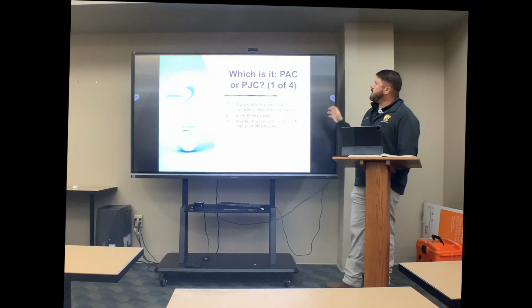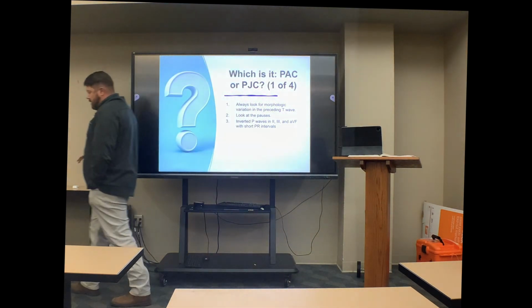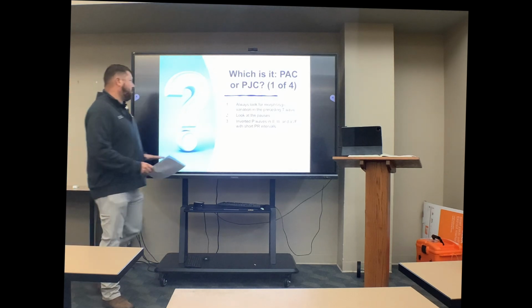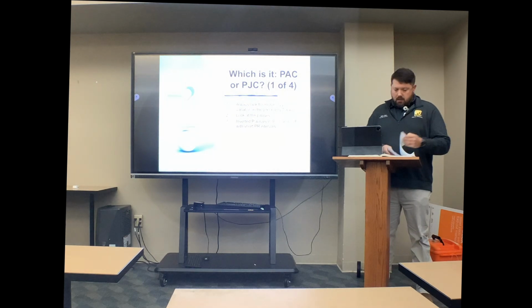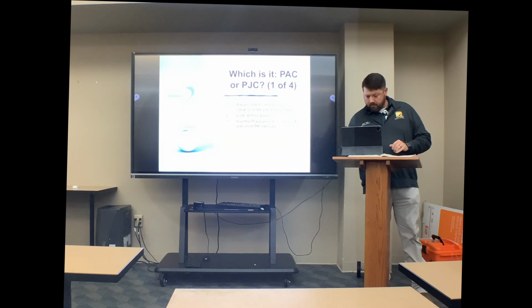Now, a couple of ways that we could tell, because remember with our PACs, we did see at times some inverted P waves, and there's a couple things you can do to identify that when you get a 12 lead. I'm not going to worry about a 12 lead right now, but you would look at 2, 3, and AVF. And then we'd also look at the preceding T wave as well. Okay?